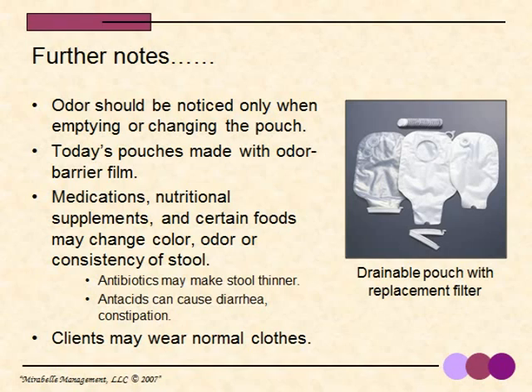I have a few further notes before we finish this module. One is that odor should be noticed only when emptying or changing the pouch. Today's pouches are made with an odor barrier film inside of them. And medications, nutritional supplements, certain foods may change the color, the odor, or the consistency of stool. For instance, antibiotics may make stool thinner, and antacids can cause diarrhea and constipation.